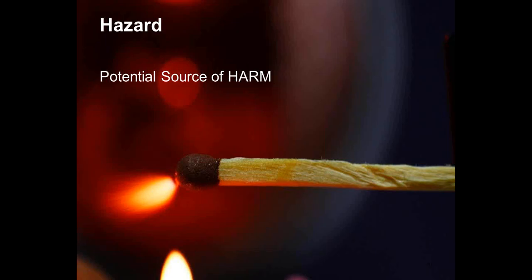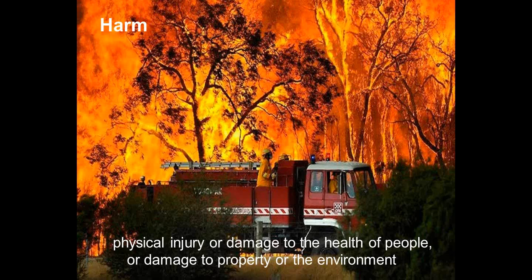What is hazard? It is a potential source of harm. For example, a matchstick. We all use a matchstick at home, and we all have a hazard in our hand. But when we are using it in a controlled manner, the potential source of harm is less. Now, if I use this matchstick and I end up in a fire like this, then this becomes a hazardous situation and a harm.